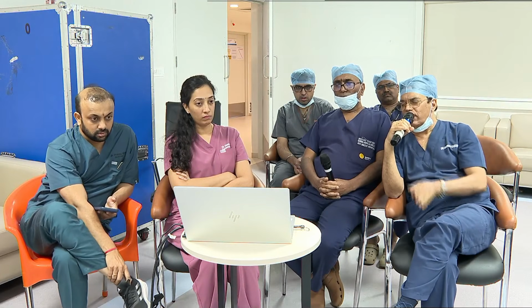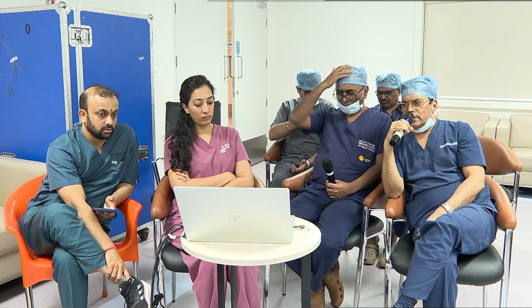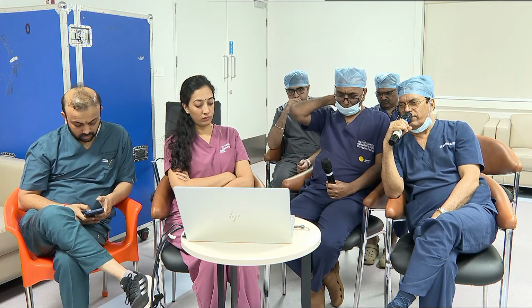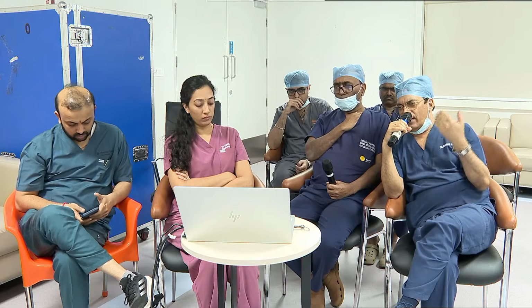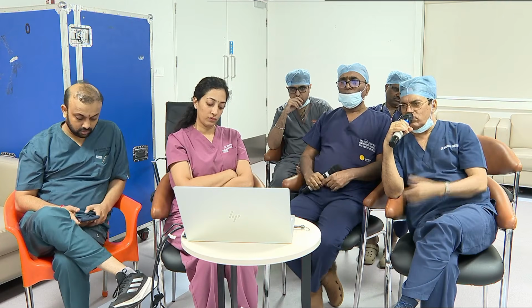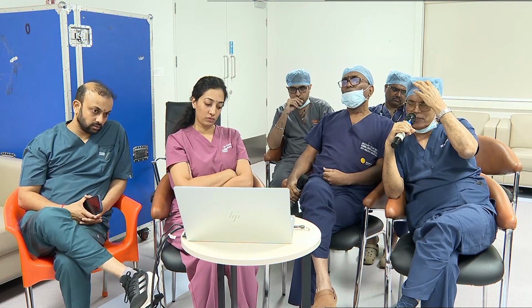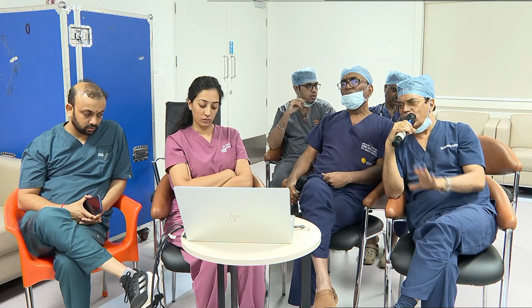If you don't have a peripheral access nicely, especially the iliac junction, many times they will have severe calcium. At that time device delivery is very, very difficult, tracking difficult. You may have to go through the left brachial approach, put the snare, or contralateral, put the snare, and these are the techniques you have to follow. And IVL is a very useful tool in modifying this peripheral calcium, so that you can access through the femoral very easily.